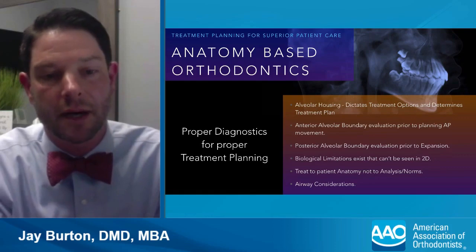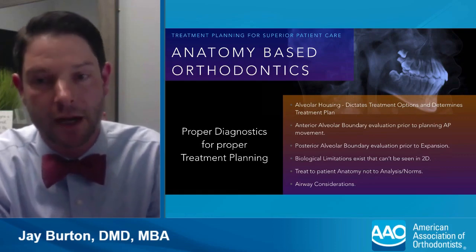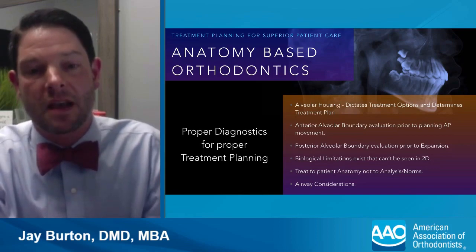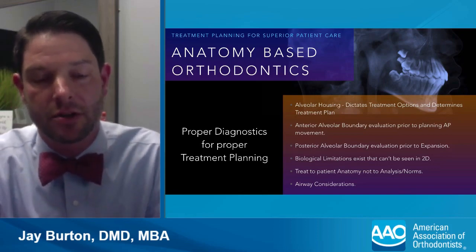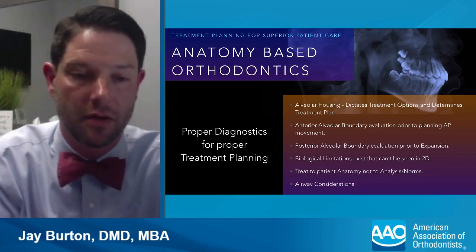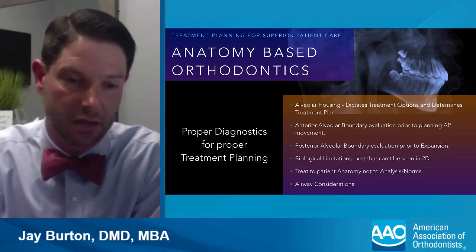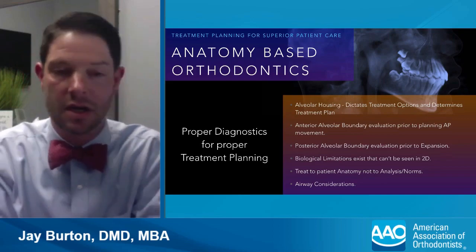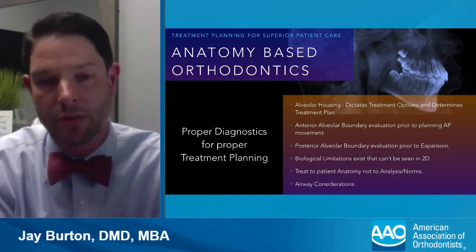It's letting me look at the biological limitations that exist because we're working on a patient that you cannot see in 2D. And it really allows you to treat that patient to their anatomy, not to these racial norms and analyses that we're used to dealing with. And it also lets you take into consideration airway in all three dimensions of space.